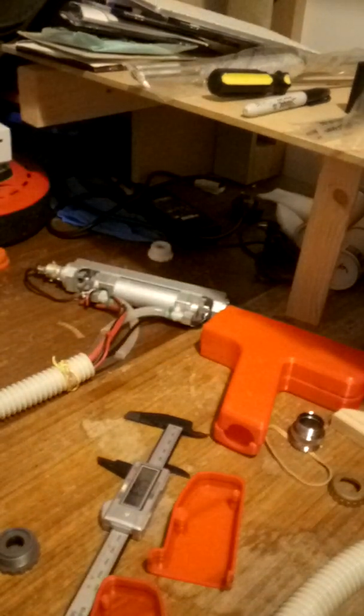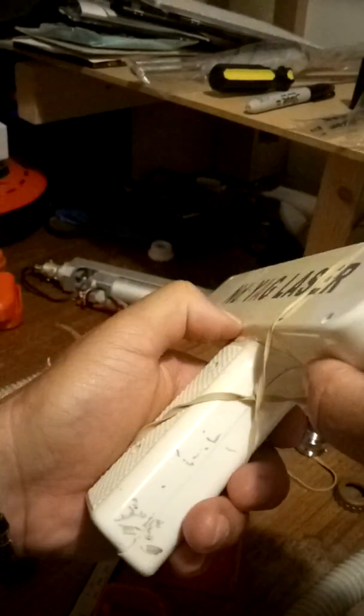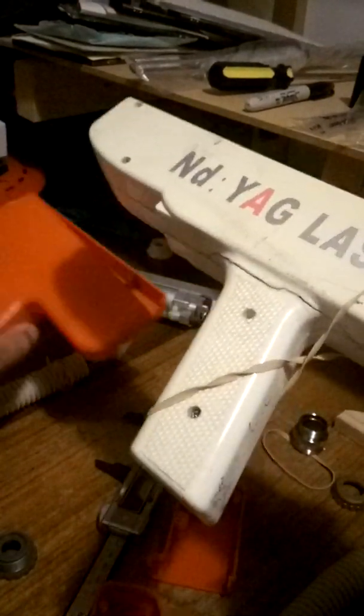I'll show you a little example. Here's a handpiece earlier. Again, it's got elastics on. And that's what I meant. Can you see how I've got that bevel there? And on my one, there's no bevel, it's completely straight. And the reason I chose to do that is this. It is weak under here because it's thinner, and just under there it's thinner, so the stress will snap at the easiest points. For example, just across there, that's no good. So to reduce that where it wants to crack and break, the easiest way for me to get around that was to strengthen that area to reduce that, and that is of course making it a solid.